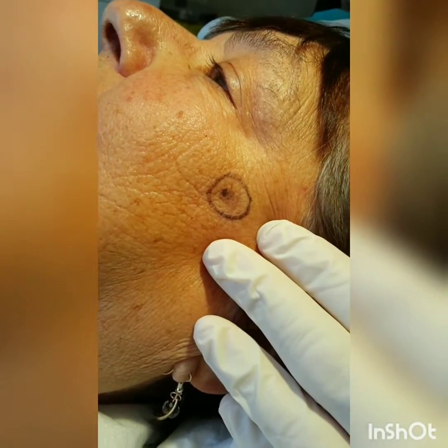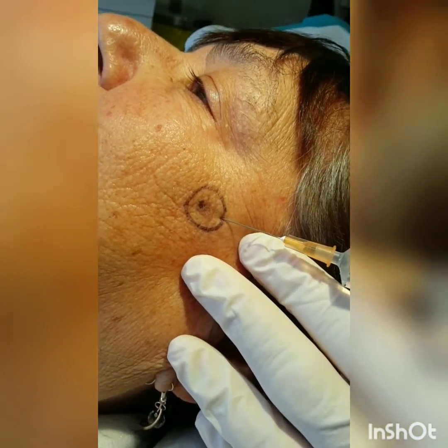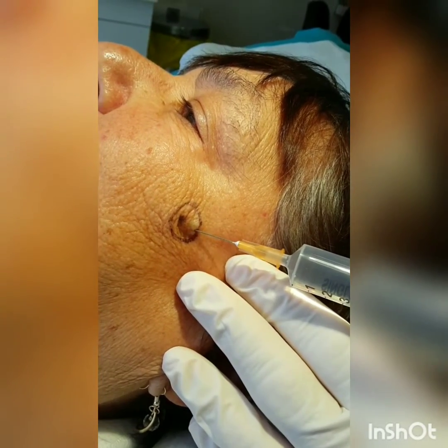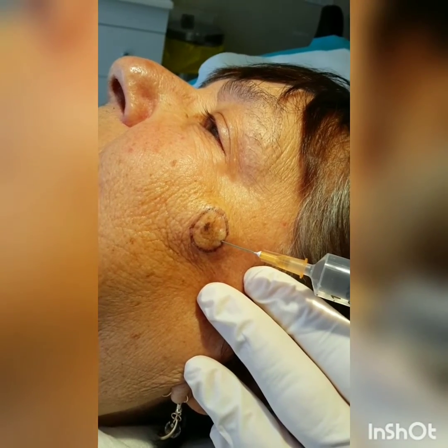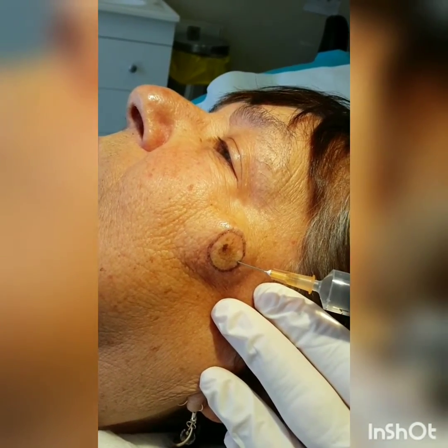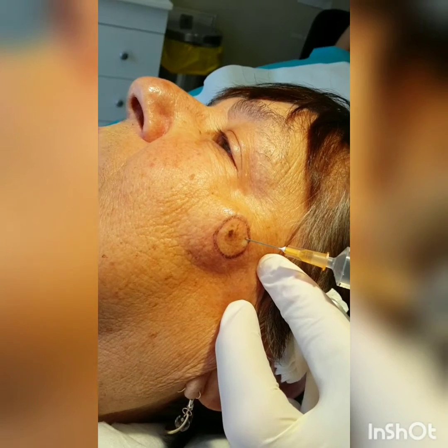To do a shave biopsy, we have some plain local anaesthetic, which we infiltrate into the area. The needle tip is placed just under the skin and a bleb is raised. Anaesthetic superficial like this is painful but works densely and quickly, and by blebbing that skin — placing it under tension and raising it — it makes the process of shave biopsy easier.